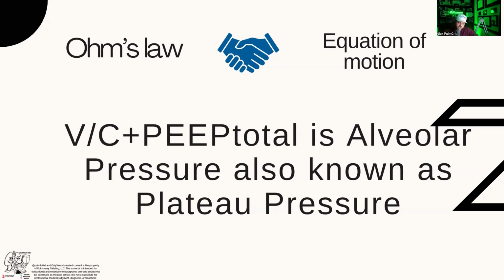So if you use pressure control with ARDS, let's say, you need to be cognizant of the volumes, because remember, the vent's not going to alarm for peak airway pressure because we set the peak airway pressure. Unless you set it high and then it alarms, but why would you do that? It's not going to alarm ever in pressure control for peak airway pressure because we set it. So that's an important thing to consider.